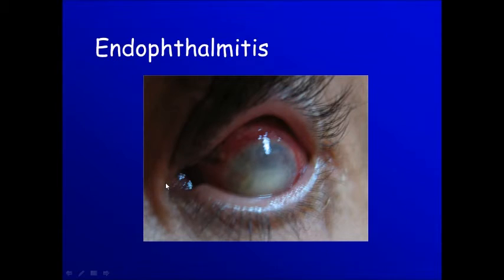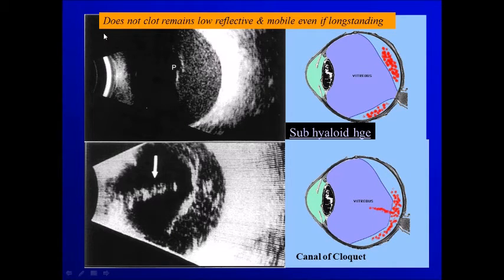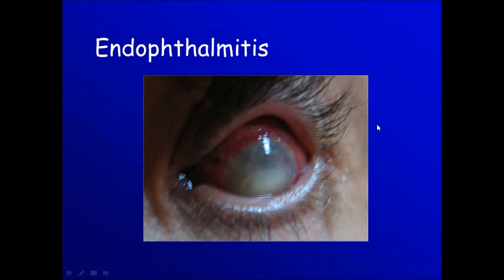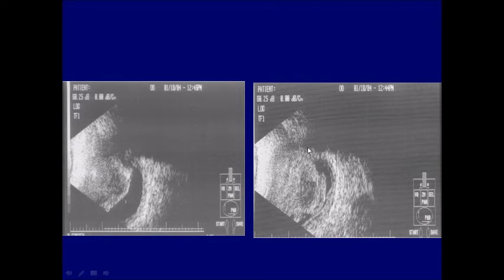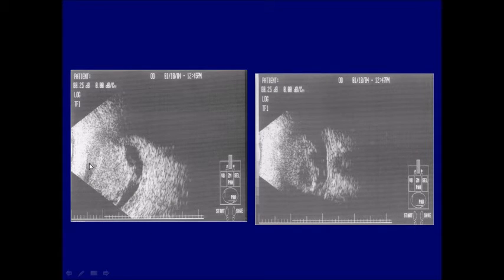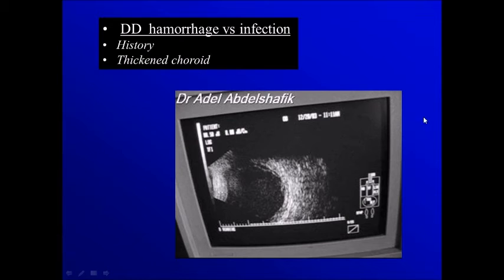Here the hemorrhage finds its way into the canal of Cloquet. The character of the subhyaloid hemorrhage is that it does not clot — it remains of low reflectability and mobile even if it's long-standing, in contrast to hemorrhage inside the vitreous which clots and becomes hyperreflective. If the vitreous cavity is filled with cells, we get something similar to hemorrhage, but the difference is the history. If we see the choroid is thickened, this helps us differentiate between hemorrhage and cells — if there is infection, we expect the choroid to be thicker. Together with the history, this will help differentiate dots due to hemorrhage from dots due to infection.